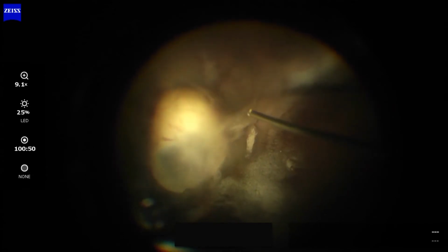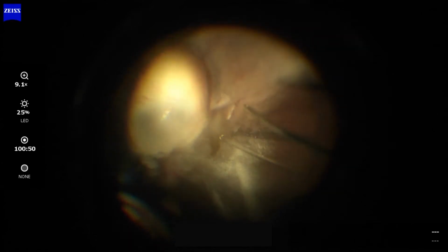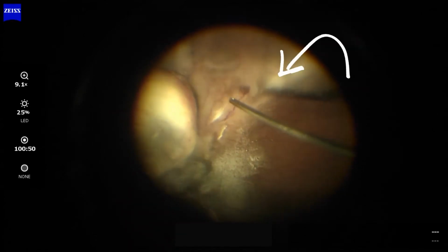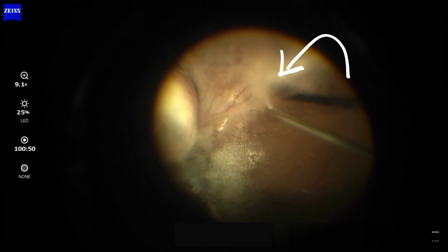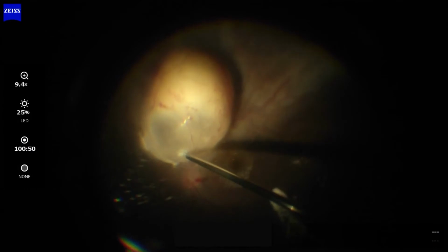Thick hyaloid sheets were removed carefully around the cyst. Here we could appreciate that hyaloid was strongly adherent to the retina, making induction of PVD difficult. The area in the inferotemporal had subretinal scarring, owing to subretinal migration of the cyst, thus inducing fibrosis along its path. Localized diathermy was made using endocautery in the retina over the cyst.